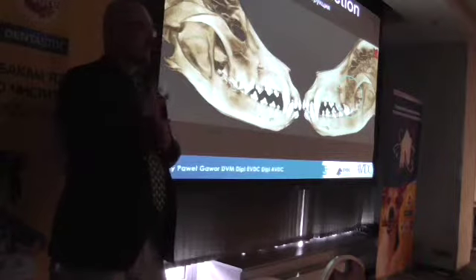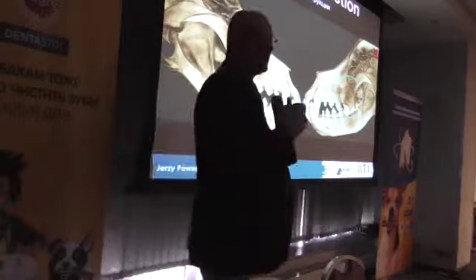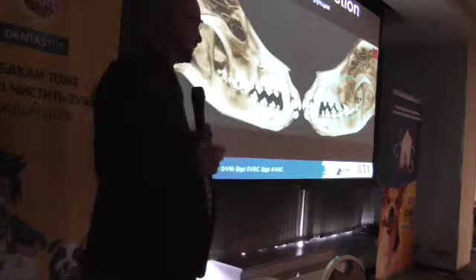So you can see that the 3D, this CBCT technology is more sensitive compared to the standard radiography.